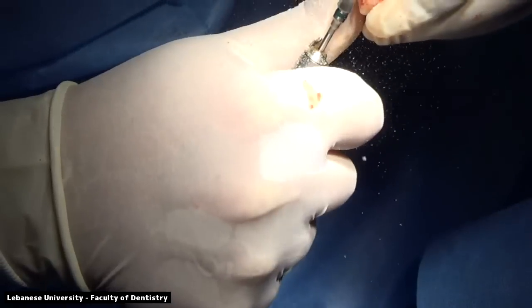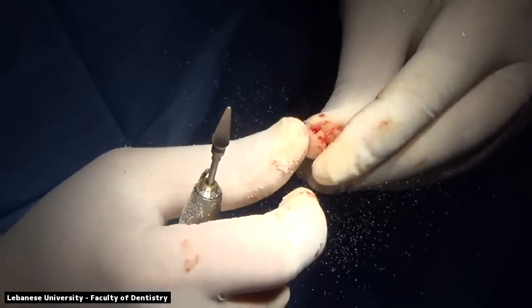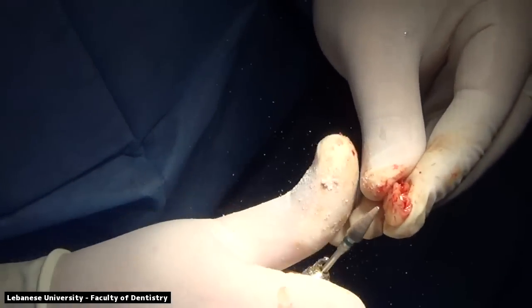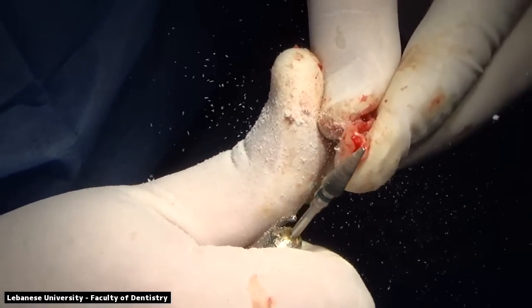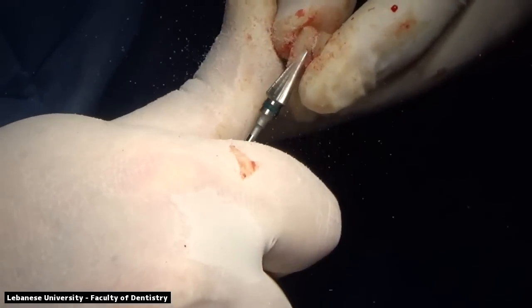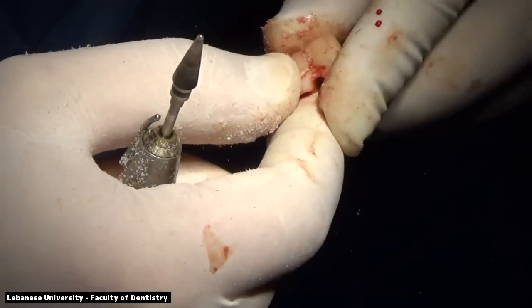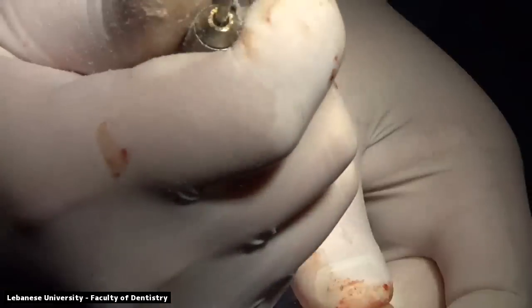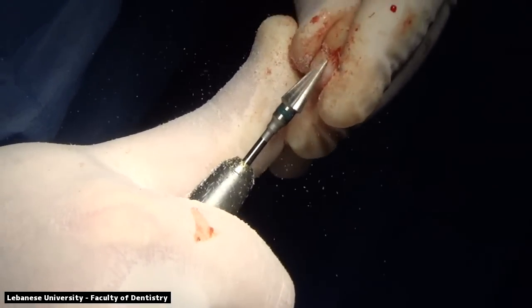So what we're doing right now is adjusting the margins and the finishing of the temporary restorations, removing any excess acrylic resin that is present, making the provisionals as smooth and as flush as possible. This will help with the adaptation of the soft tissue and prevent any bone resorption.